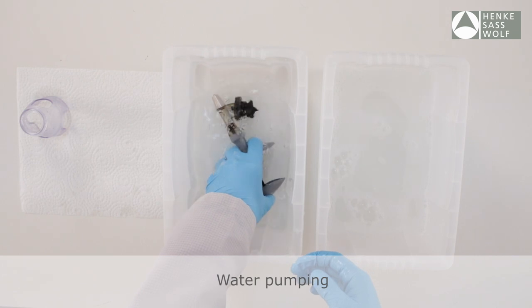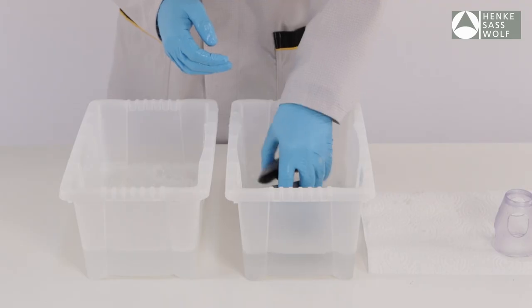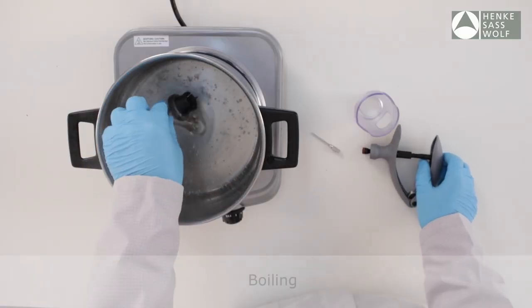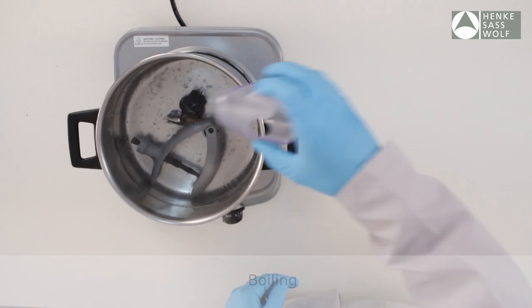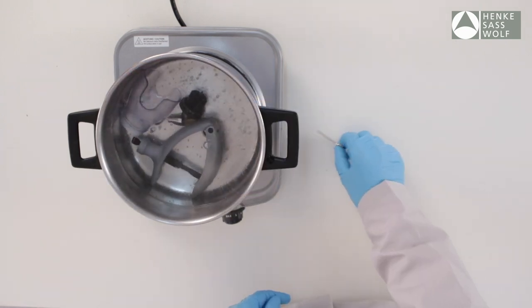To clear the blockage, submerge the syringe in clean water and pump vigorously 10 to 20 times to clear. If this does not help, boil the syringe for 20 minutes, then pump through clean water. This should help loosen any blockages.